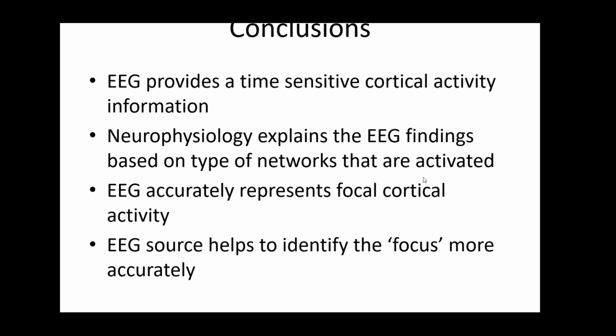We're going to jump back over to a more methodological question. What are the advantages of sLORETA over the single dipole method? So both are similar. The dipole model can give you similar information as sLORETA. They're basically looking at the same activity.